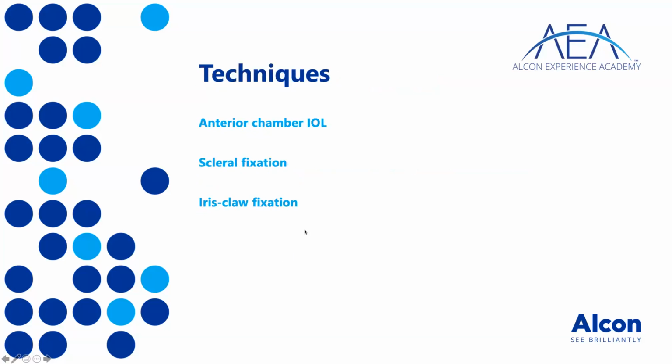We will be talking mainly about three techniques: the anterior chamber IOL implantation, scleral fixation lens with two different techniques, and iris claw fixation. About all of them, we will see what the pros and the cons are, what personally I like and I don't like about those techniques, if I use them or if I don't, when and how.